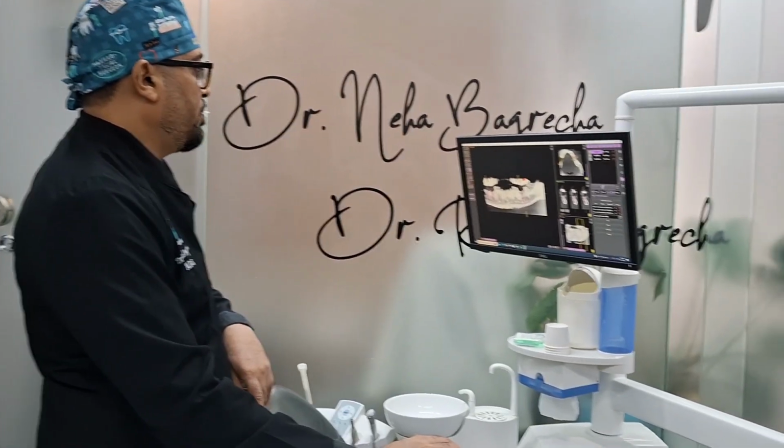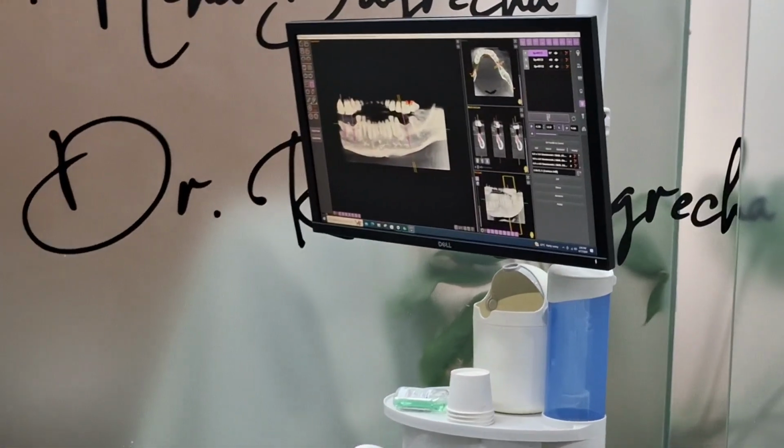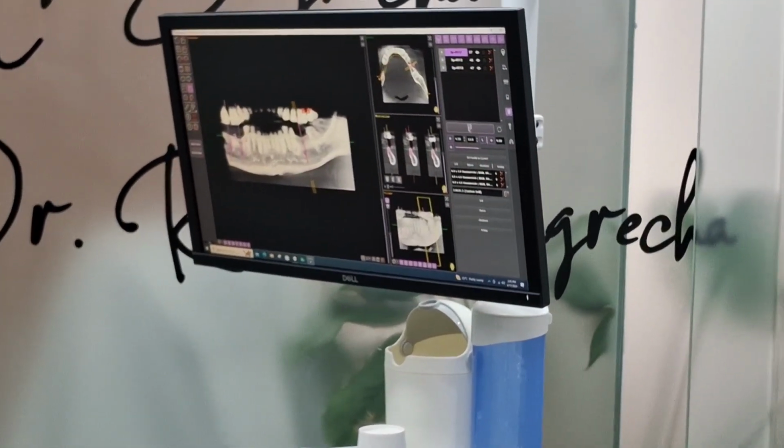Today we're done with the surgery. Normally I do my videos before the surgery and explain the surgery. Today this was a very difficult case, so I wanted to do this video after the procedure, where I could explain what I did. So today's case was a difficult case where we were placing the implant in both molar regions.